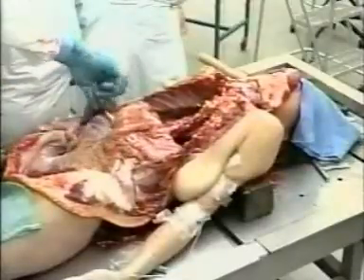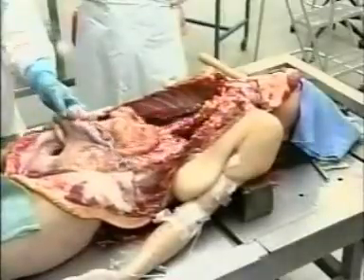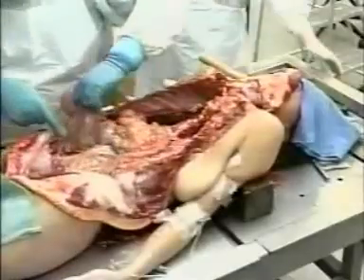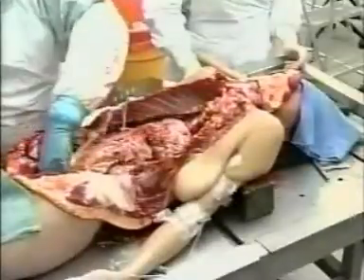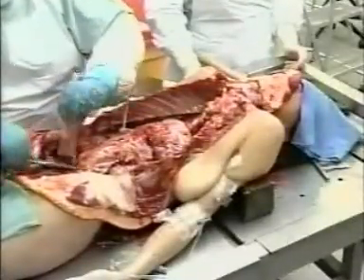What he's doing now is he's putting a clamp on the proximal end of the small intestine, the duodenum, and then he'll free up all of the intestine so that it can be removed in a block. And there we go.